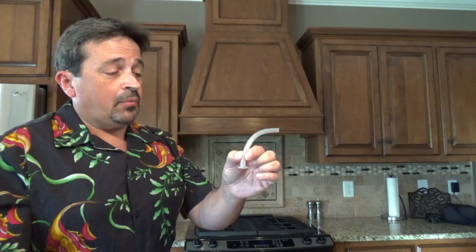So again, with some kinds you can move the flange and set it there. You could also, if you know ahead of time that somebody has weird anatomy, trim it down. I wouldn't advise that very much. I'd rather have it a little bit too long than too short, so you make sure that you're behind the tongue.